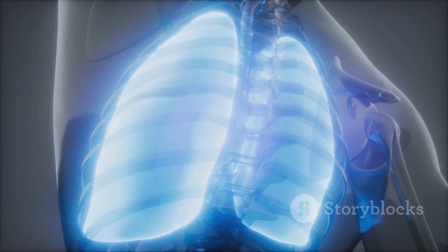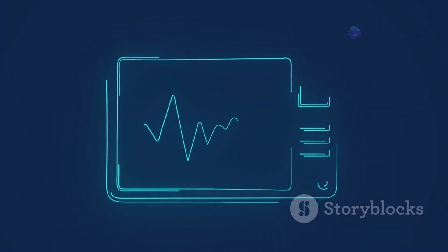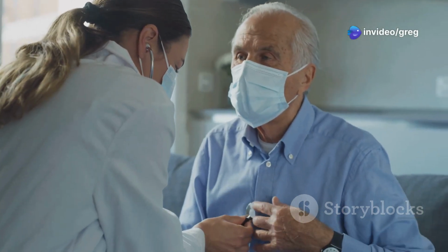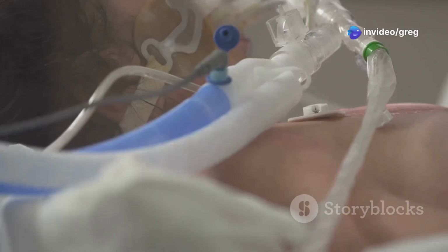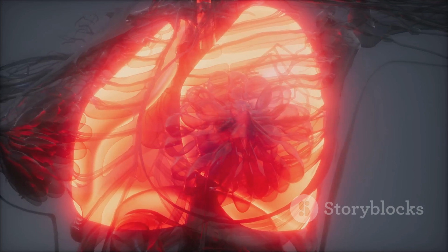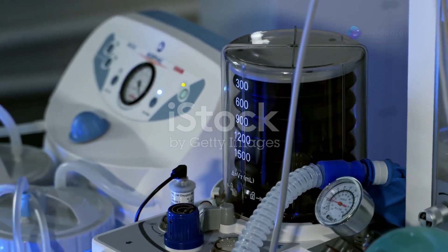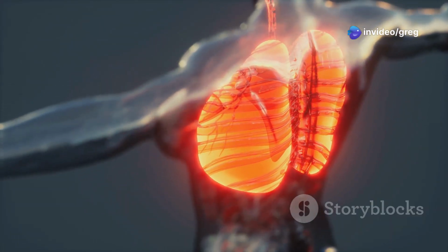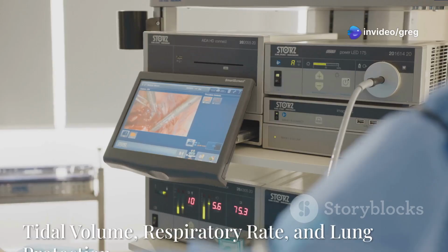Barotrauma results from high pressure in the lungs, often caused by high airway pressures during mechanical ventilation. This can occur due to factors such as reduced lung compliance, airway resistance, or rapid inspiratory flow rates. High pressures can rupture the lung tissue, leading to air leakage into the chest cavity, known as pneumothorax, the space around the heart, known as pneumomediastinum, or even into the bloodstream, known as air embolism.